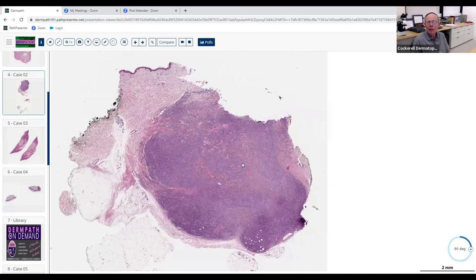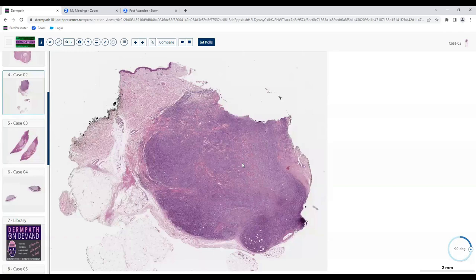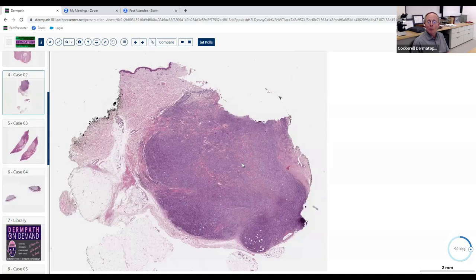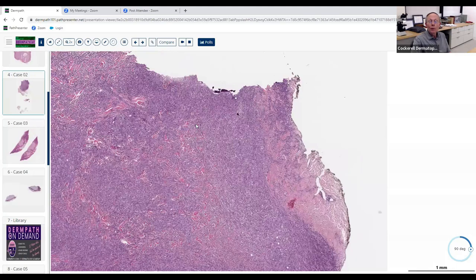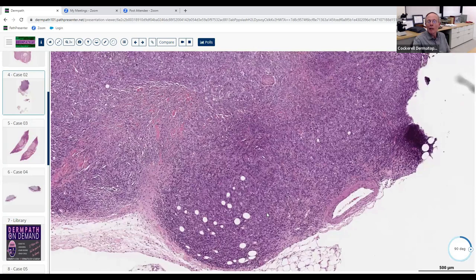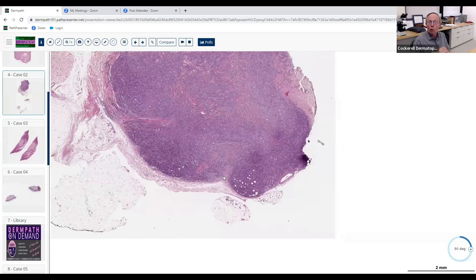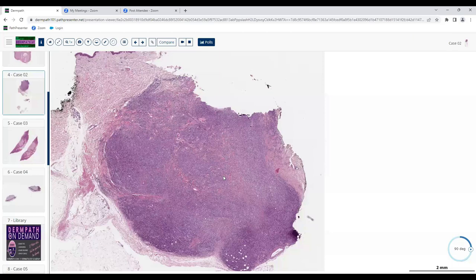What do you mean by infiltrative? Well, I see collagen trapping, the cells going down into the subcutaneous fat — it looks like those cells are moving into this area rather than forming a solid, well-circumscribed tumor. Exactly — poor circumscription, involvement and near-replacement of the subcutaneous fat with neoplastic cells — those are all signs of malignancy.